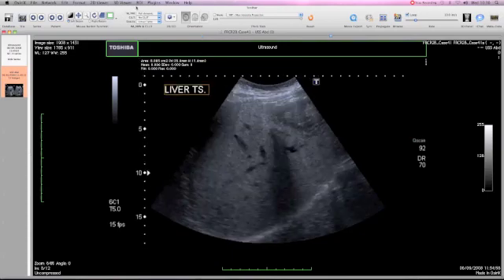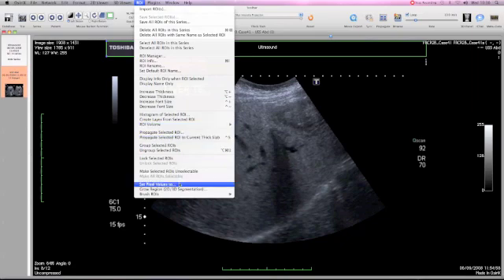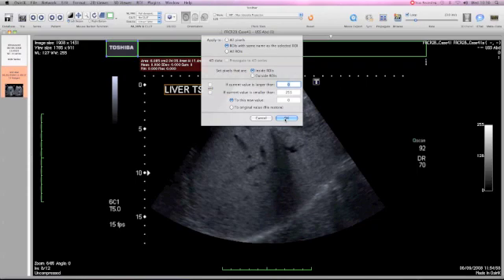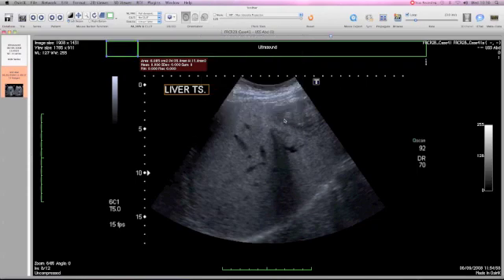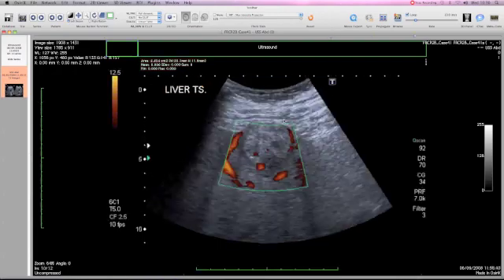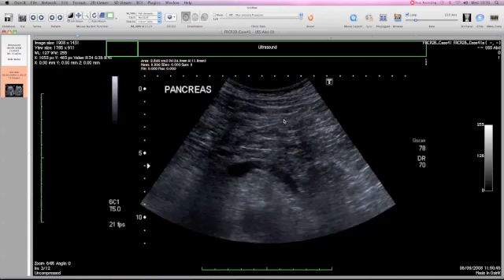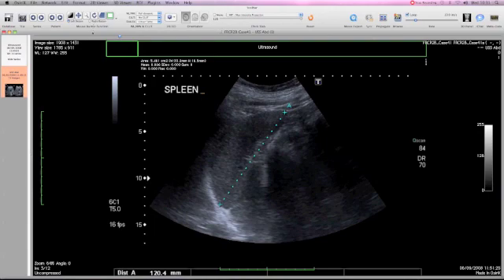In order to black out the Toshiba, we again go up to the region of interest column. We go down to set pixel values, and these will be automatically set at an appropriate level. And if we select OK, this will automatically turn all of the areas over the Toshiba, and all of the images black. A similar function could be performed to overlie the patient name, in this case in an ultrasound, but you could also do this for a nuclear medicine examination as well.